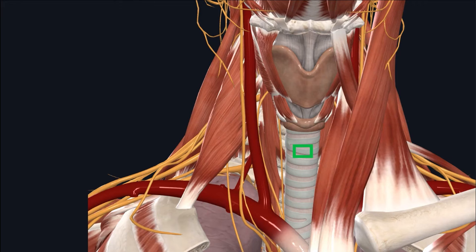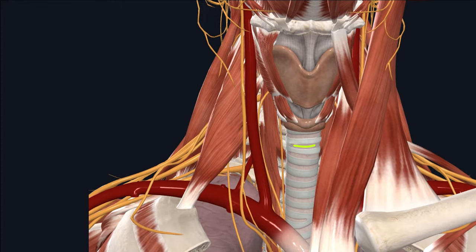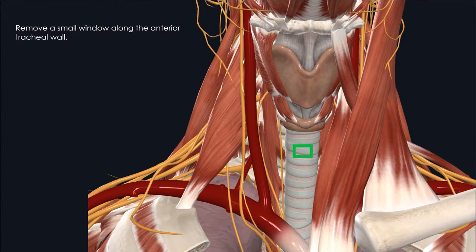Next, we'll discuss different types of tracheal openings you can use. There are three commonly used approaches: one option is to use a small window technique along the anterior tracheal ring; another is to use a Bjork flap; and the third is creating a linear incision between the second and third tracheal rings. My personal preference for most patients is to create a box-shaped small window opening along the anterior tracheal wall.